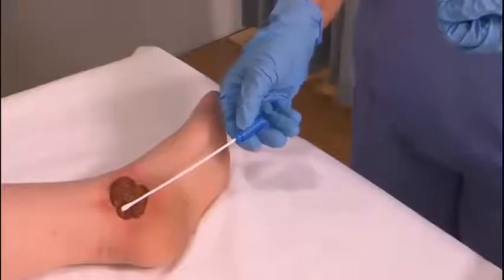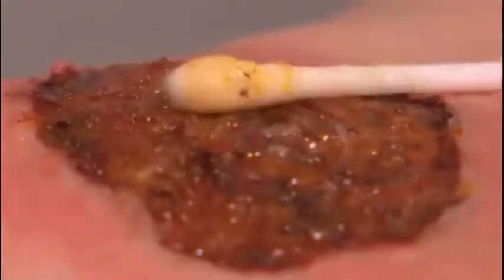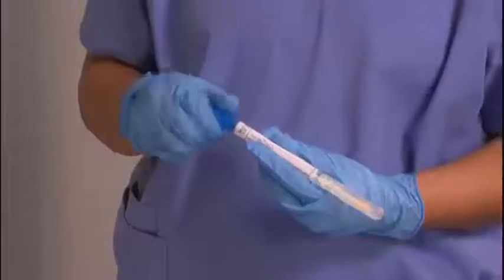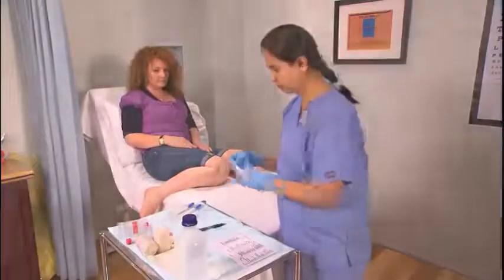Gently place the swab over the wound and rotate the swab while moving over the wound. Ensure it is well covered in exudates. Place the swab in the transport medium. Label the container and place it in the transport bag.